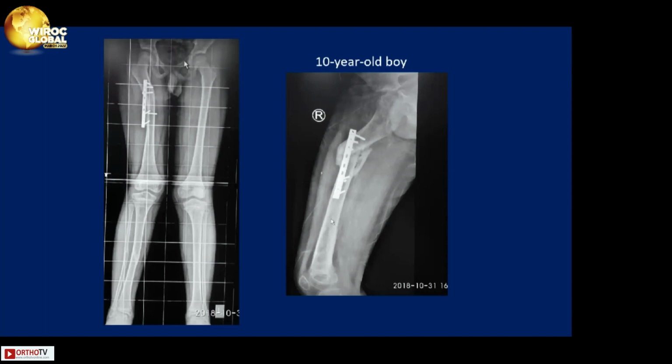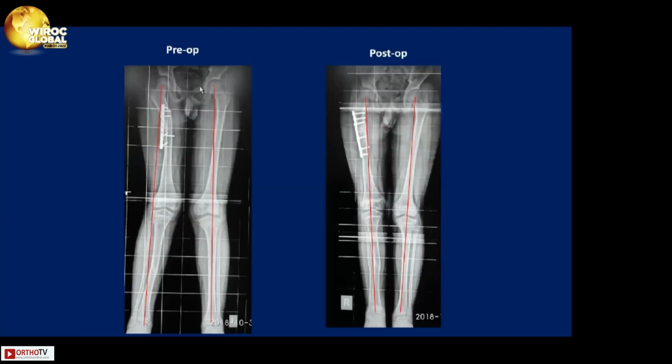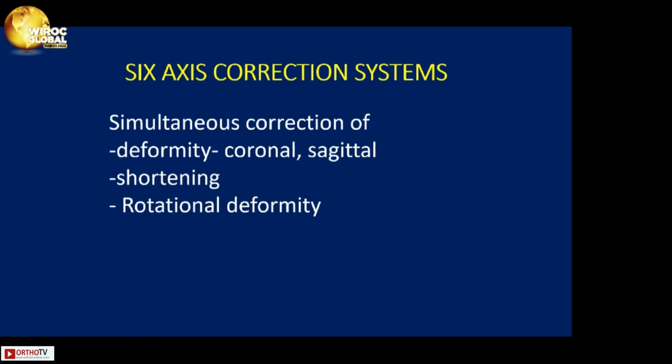Sometimes, even though the deformity looks complex, it can be tackled with a simple internal fixation device, like this malunited femur with valgus procurvatum deformity, which was treated with a pre-bent plate, and it did the trick. It went on to heal well.